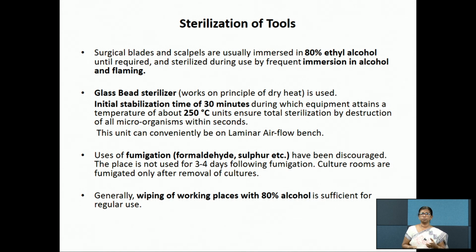If you are using fumigation, you have to move all the bottles elsewhere, and then go for fumigation. Fumigation with all the cultures kept inside is detrimental to the culture also. So that should be avoided. Better to clean all the surfaces using alcohol. Wiping the working place with 80% alcohol is sufficient for regular use.